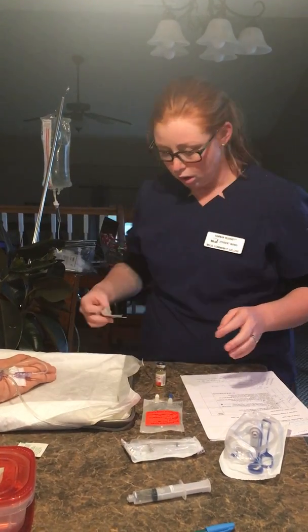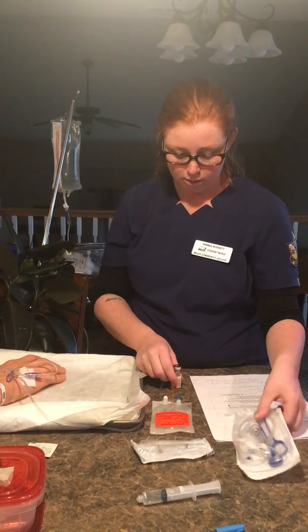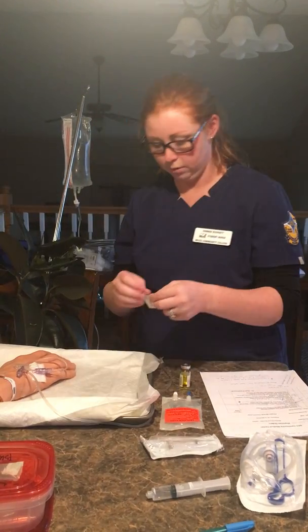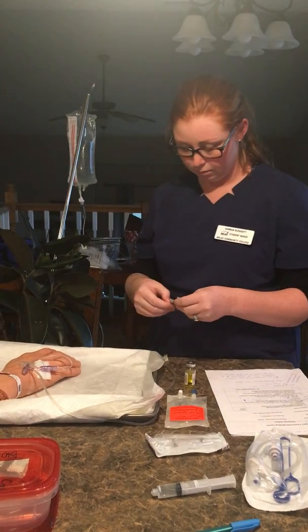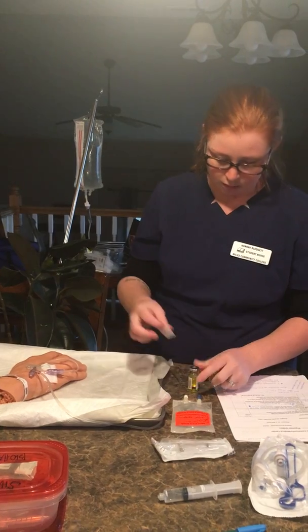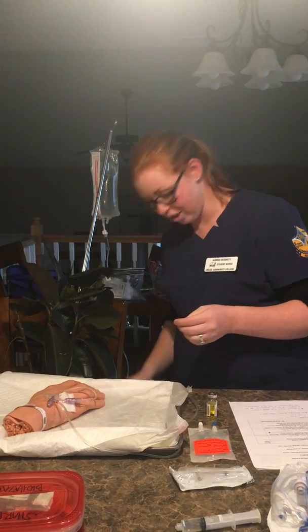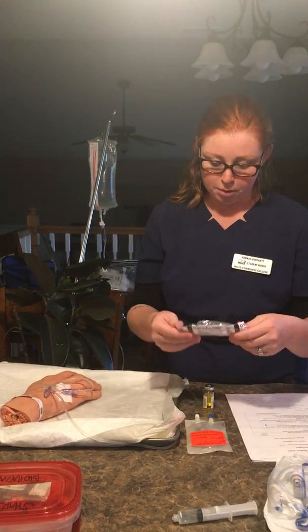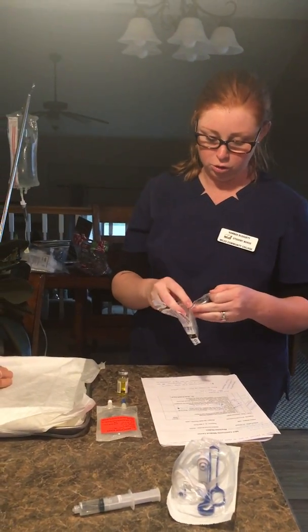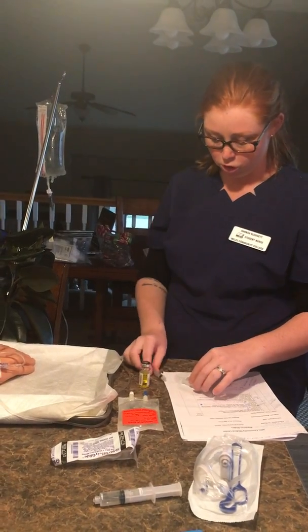So after we've got that ready to go, I'm going to go ahead and clean the top of this off really good. And this medication port — that's what I'm going to use to insert the medication. Here's my needle here. And again, we're going to be using two milliliters.